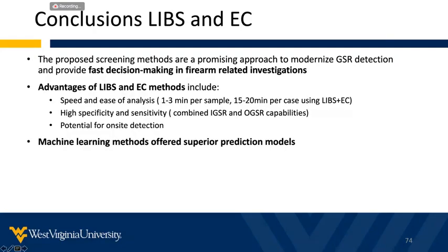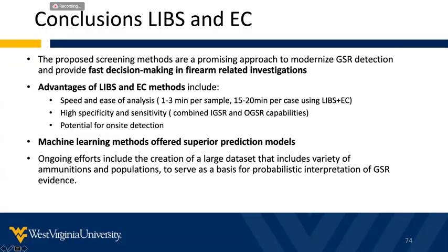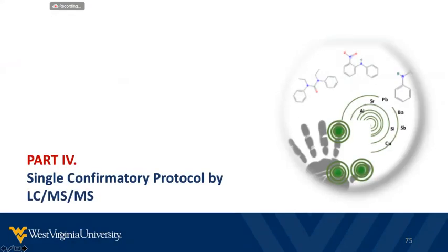Machine learning algorithms offer a superior prediction model in this analysis, and ongoing efforts, including the creation of a larger data set that includes a variety of ammunitions and populations to serve as a basis for probabilistic interpretation of GSR evidence, is expected. So with that, we're going to continue with part 4 of this webinar that includes the single confirmatory protocol by LC-MS/MS.